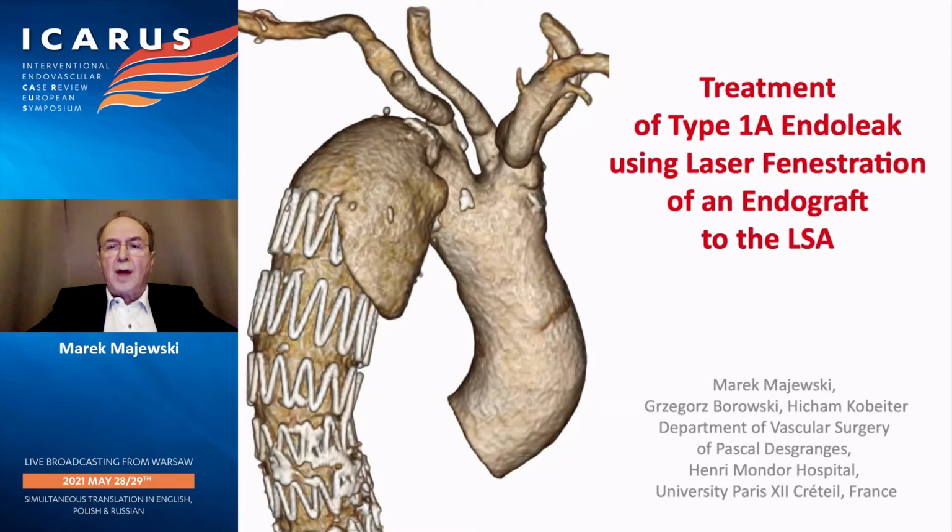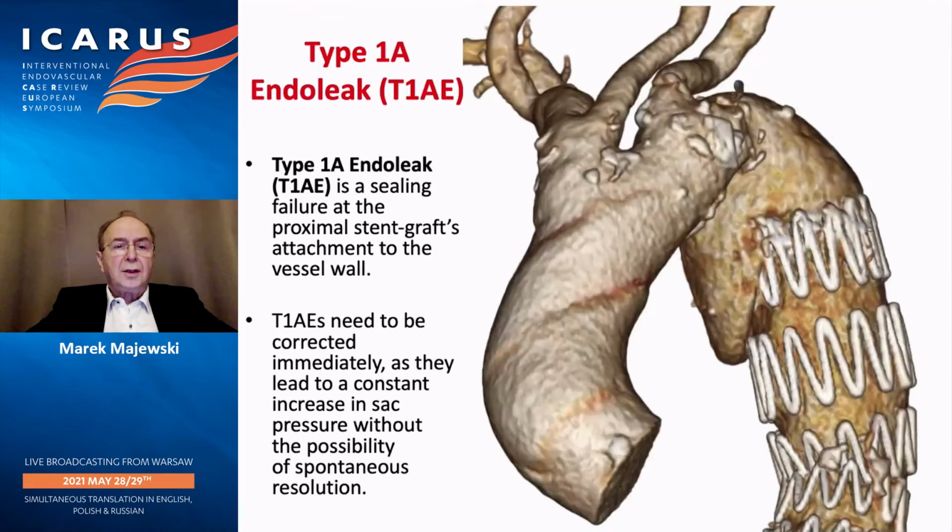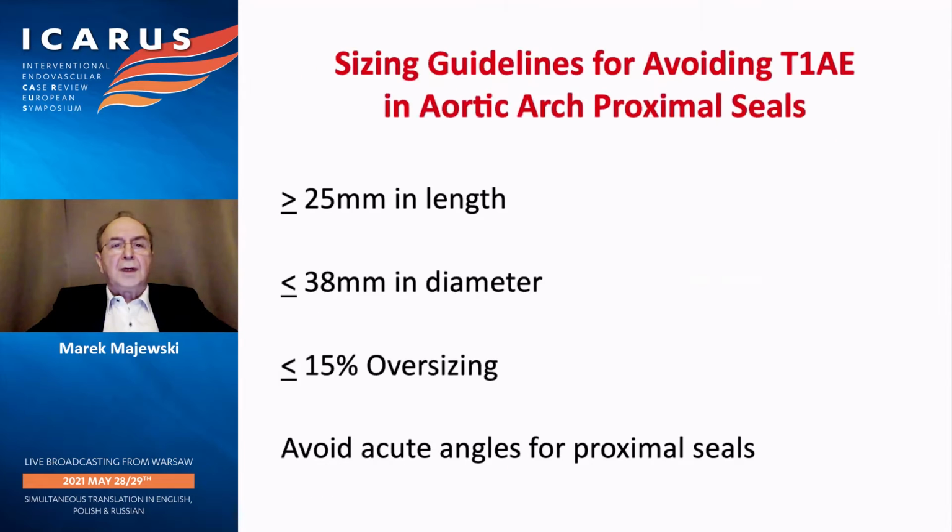I want to thank Grzegorz and Jan for the opportunity to present my topic and case: treatment of type 1A endoleak using laser fenestration of an endograft to the LSA. Type 1A endoleak is a sealing failure at the proximal stent graft's attachment to the vessel wall.